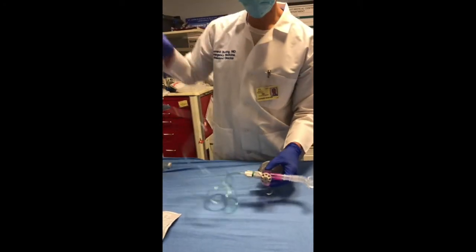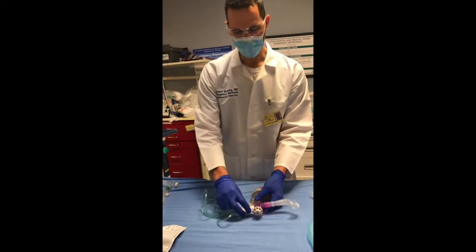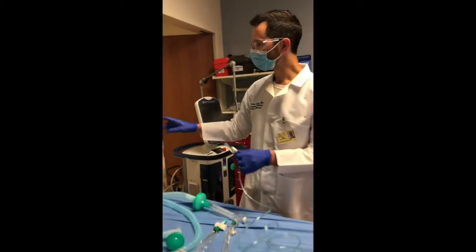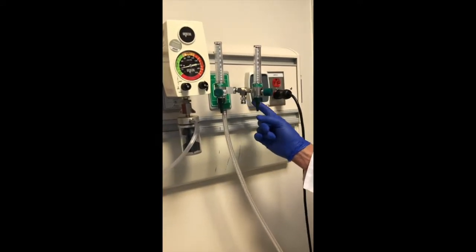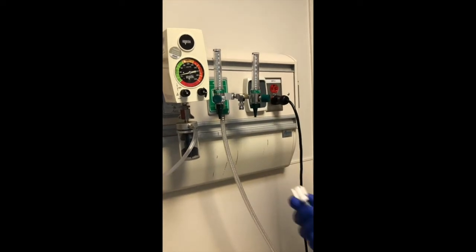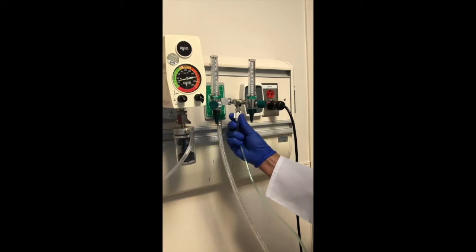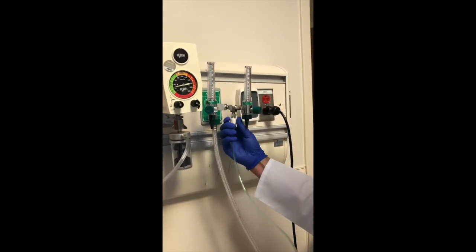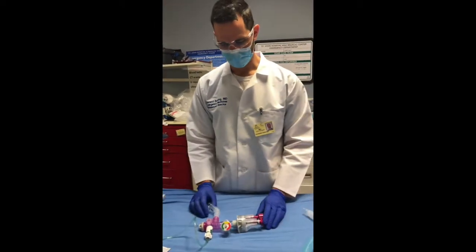Next, you will come over and connect this to your high flow port on your flow meter. On our flow meters, it is this port here. This will deliver 50 PSI of oxygen. I'm going to screw it on. When I make the connection it's going to make a loud noise, so I'm going to unscrew it for a second so that we're not dealing with that noise while I point out the rest of the connections on the Vortran.